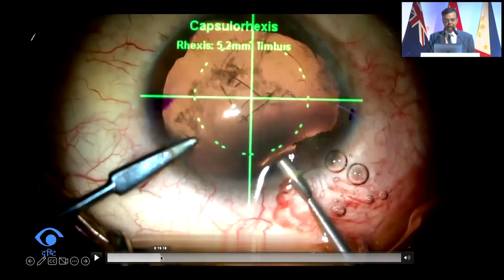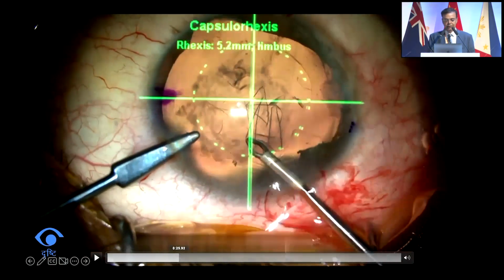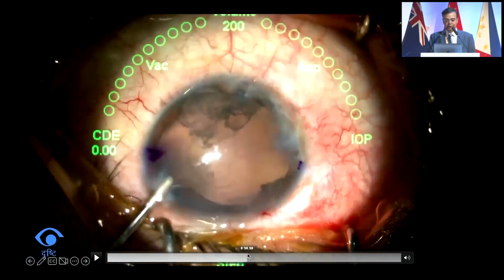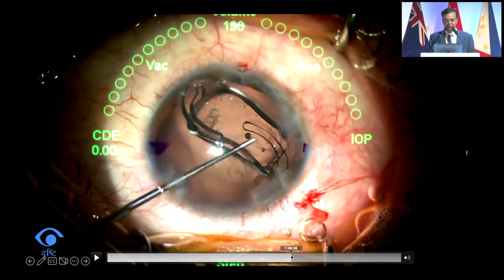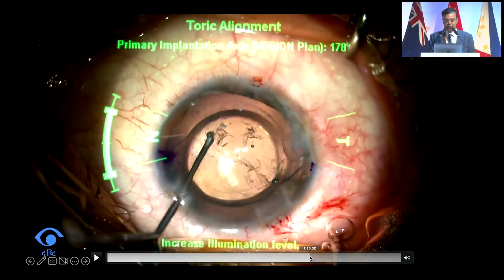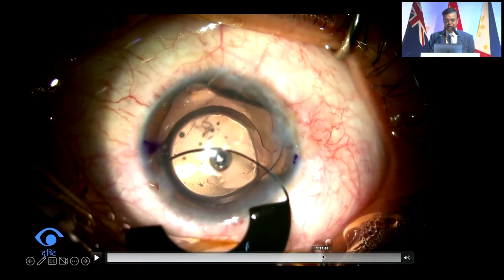It was a soft cataract, and you can see here that it was just aspirated. Now the challenge was that we had a 2.2 incision, and we wanted to implant that segment after the lens was implanted. There were 2 thoughts. One was to put that in the bag, but then we quickly realized that inside the bag there's not enough space to get this segment in.